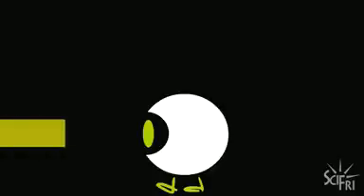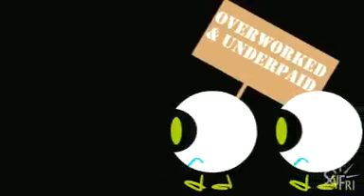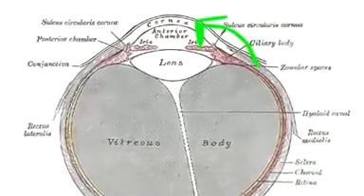The eye's job is to focus light on the retina, but when you're nearsighted or farsighted, your eyes aren't doing their jobs. They're focusing light in front of or behind the retina. By doing laser vision correction, you do what glasses and contacts do. You change where the light focuses. By zapping the cornea with a laser, you can change the position of that focal point.